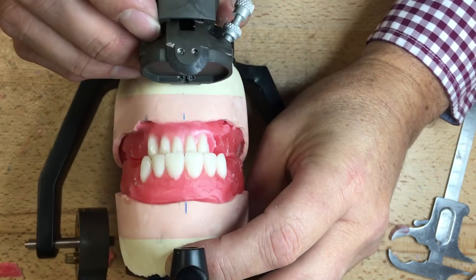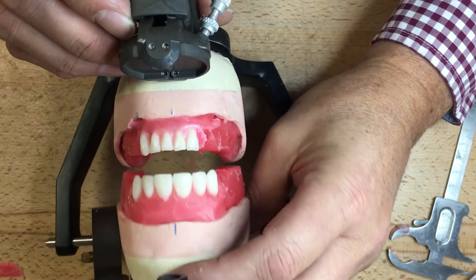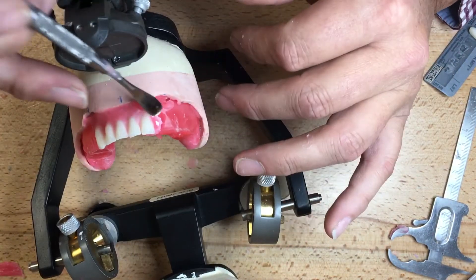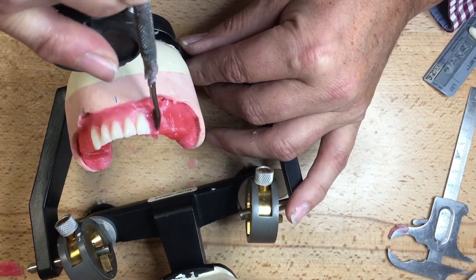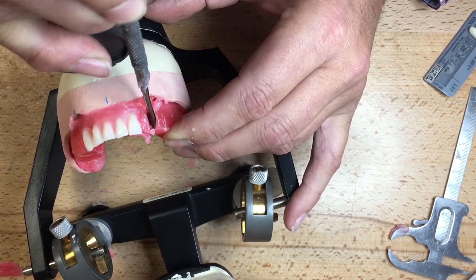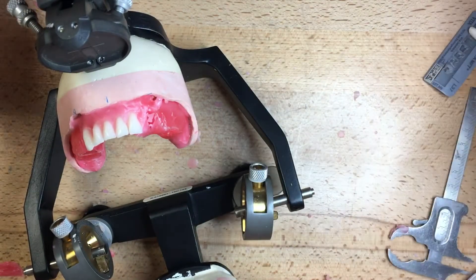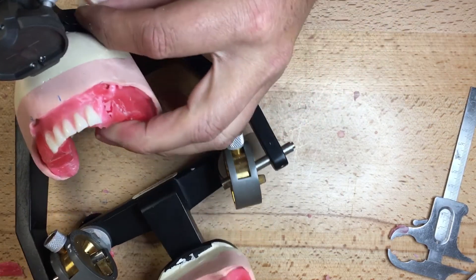Looking at the freeway space when I open this, I've got the same amount of daylight and freeway space — I don't have one sticking up above the plane of occlusion. I'm being a little cavalier doing it by eye and not using a setup plate yet, but I'll reintroduce one shortly. I'll probably reserve the setup plate more for when I get to the posterior section. I've got one more tooth to set up for the canine.